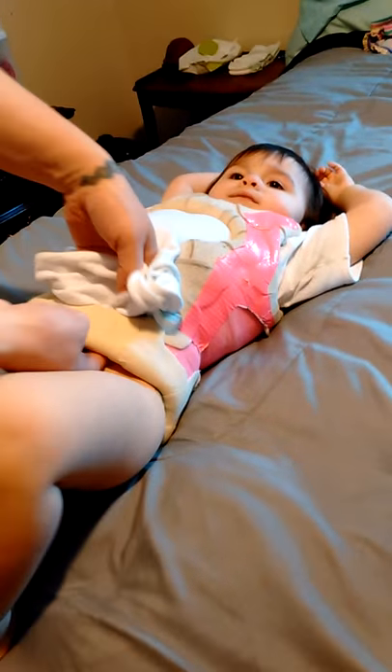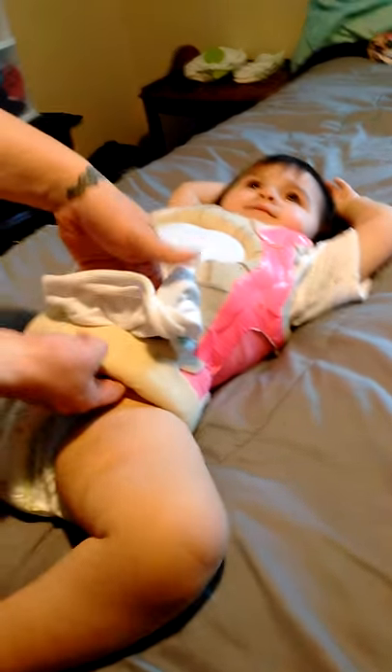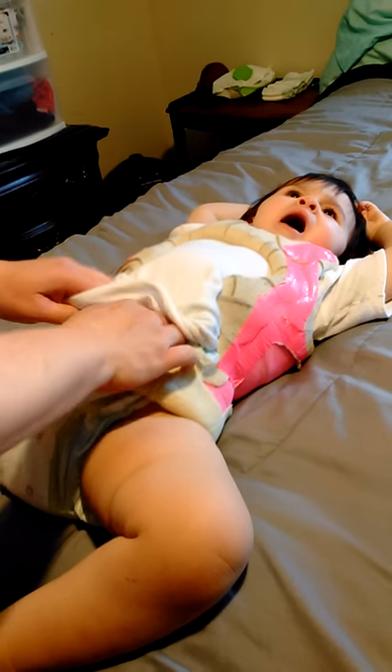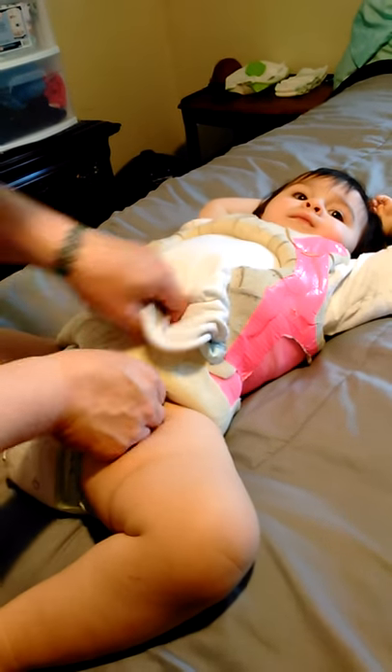This is the part we're probably going to cut out in a second, because once you get down to the bottom it's easier to lay her down, lay her down and tuck the shirt under the first part, and pull the shirt out and then just work it all the way around. But we have to take her diaper off for that part.